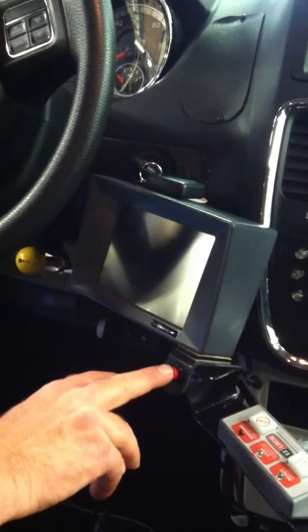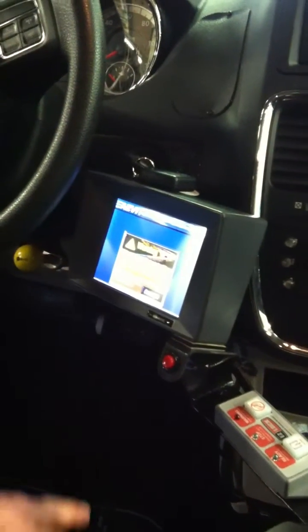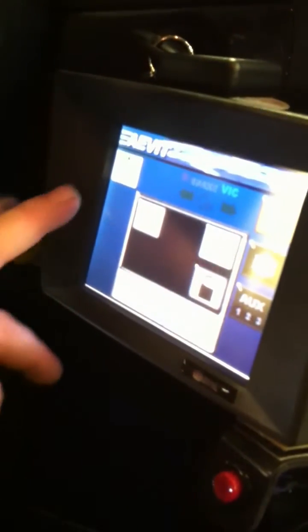First you have to wake the system up by pressing the wake up button. Then you accept it, hit your start or ignition on, then your start.